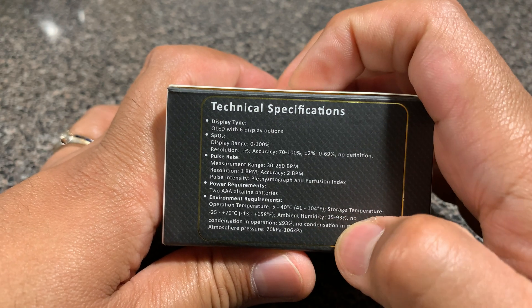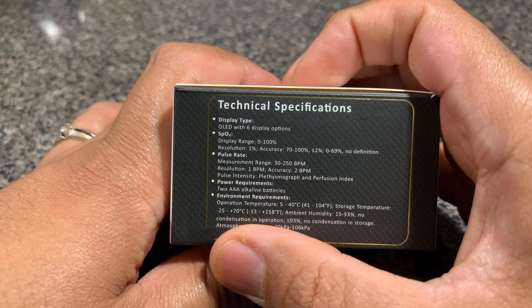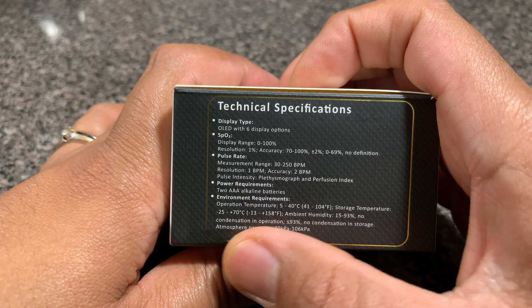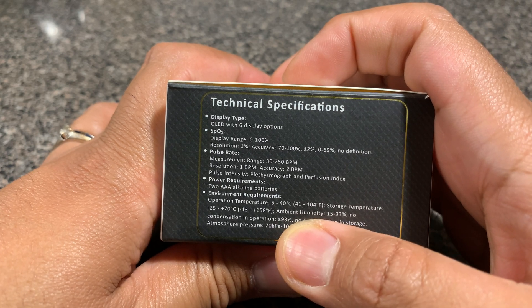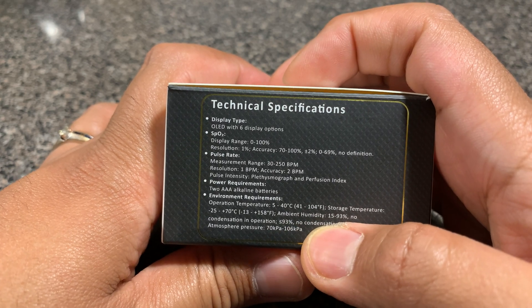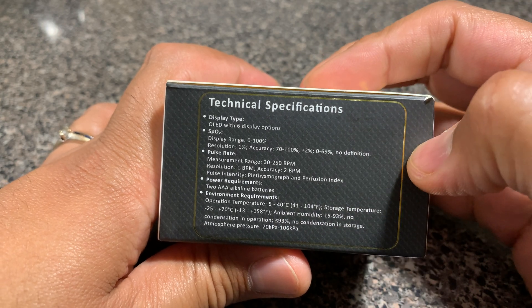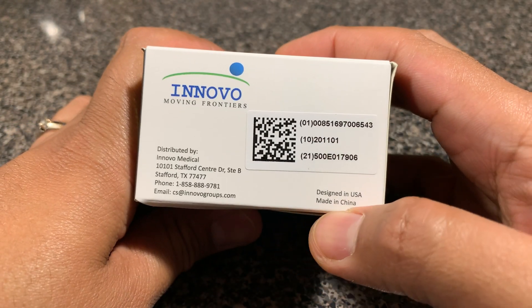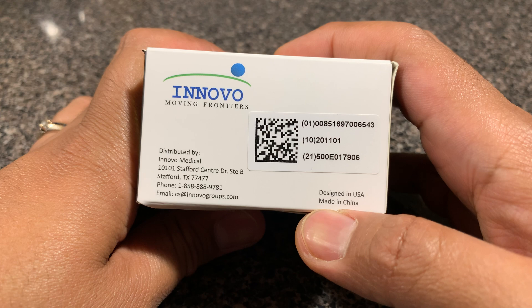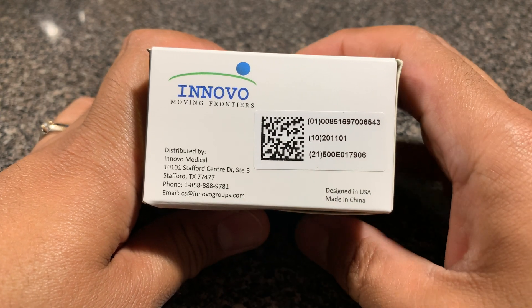As far as storage is concerned, you want to store it in a room-temperature environment where humidity is also controlled — you don't want to be in a highly humid area because the unit can get damaged. The unit is designed in the United States but manufactured in China, and there's information about the company itself on the packaging.